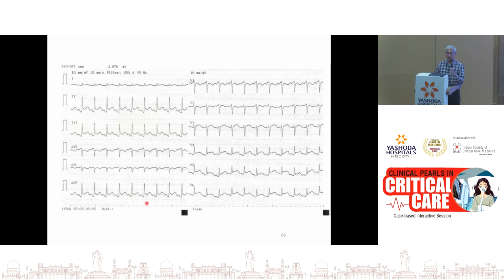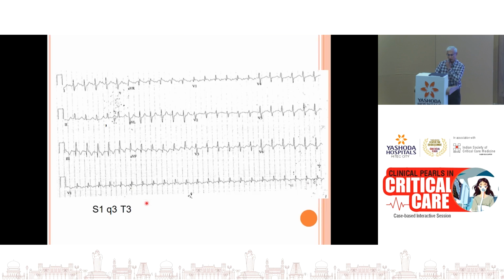So in this patient, you should not make a diagnosis of acute MI and should not give him thrombolysis, because you'll end up with a cardiac tamponade. So it's important that you recognize signs of pericarditis, which can be a mimic of acute MI.